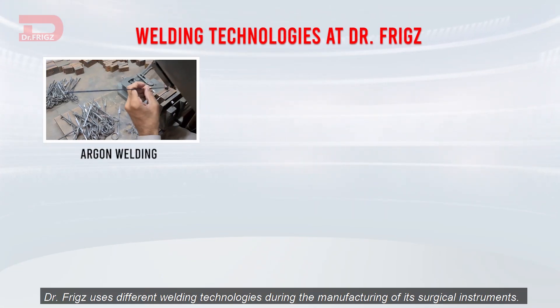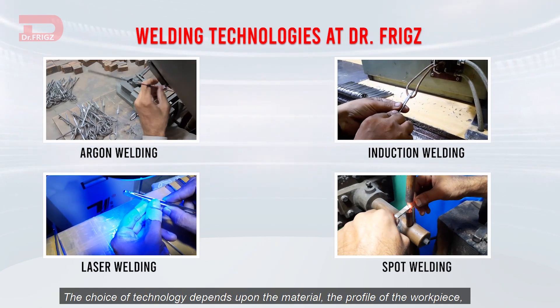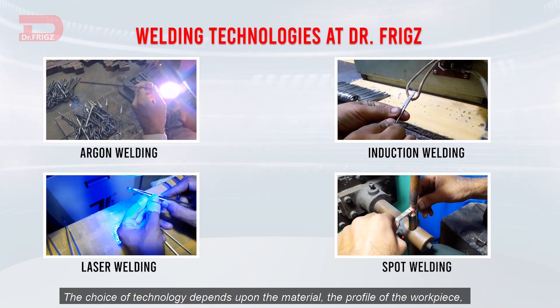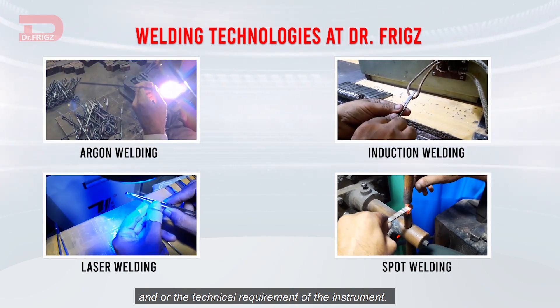Dr. Friggs uses different welding technologies during the manufacturing of its surgical instruments. The choice of technology depends upon the material, the profile of the workpiece, and/or the technical requirement of the instrument.